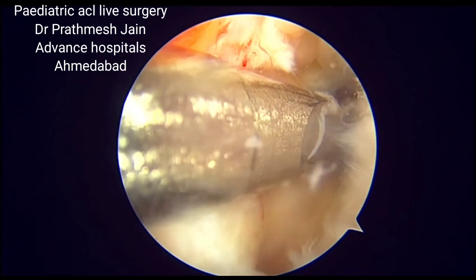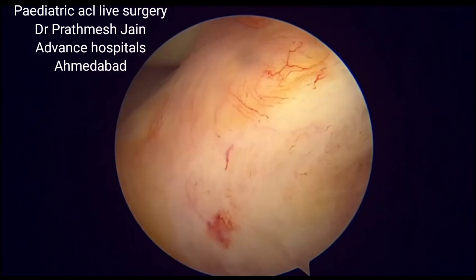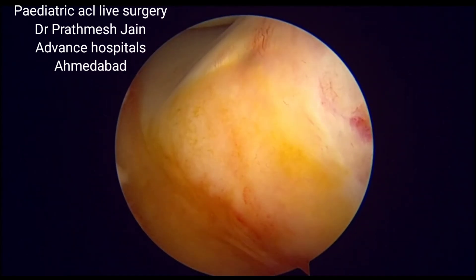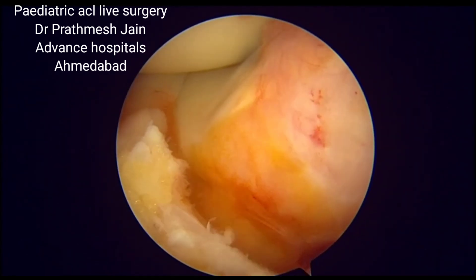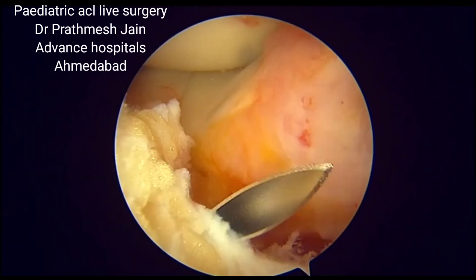This is a live demonstration of the Micheli, Kocher and MacIntosh technique of pediatric ACL reconstruction with a physeal sparing approach using a tensor fascia lata as a graft.